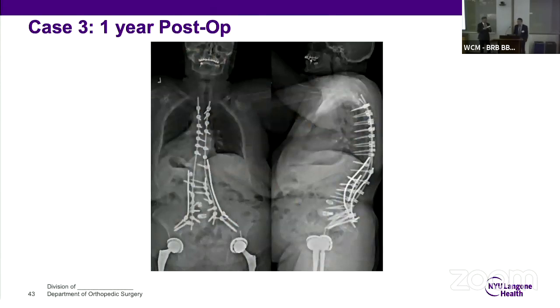And you mentioned that you plan the screw heads so it makes it easier then to pass the rod. Does the software allow you to plan screws in such a way that the screw heads are aligned, but the actual screw goes into different directions? Yeah, absolutely. You can manipulate a three-dimensional model on the computer and see, looking at it as if you're going through an axial through each level.